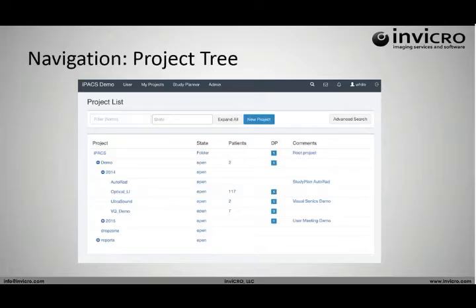In addition, there's this advanced search, which lets you do queries over data points or project parameters. People thought it was in the system for a long time, but now we've added it, and I think it's come out pretty well. We got around it in the past by coming up with custom reports that would do this, but this is really a way of streamlining the data mining on a project level, and I'll do a few examples of this later on.